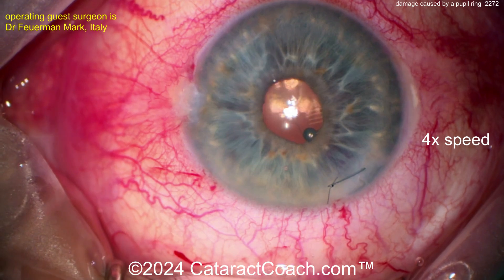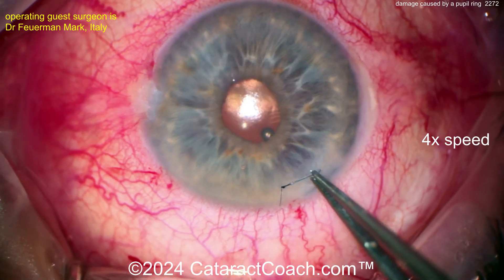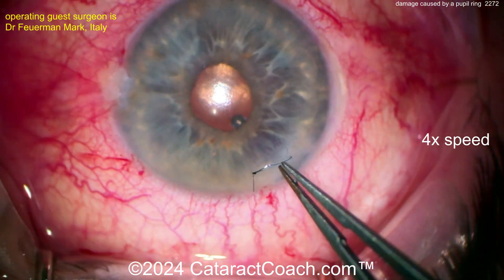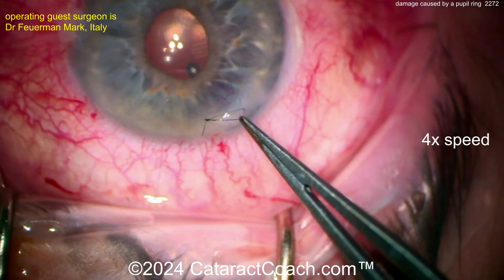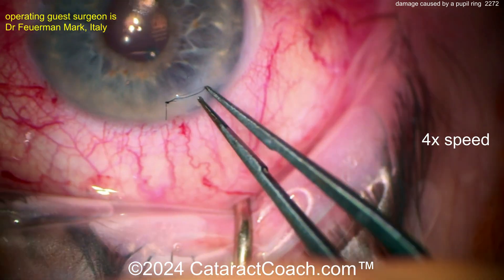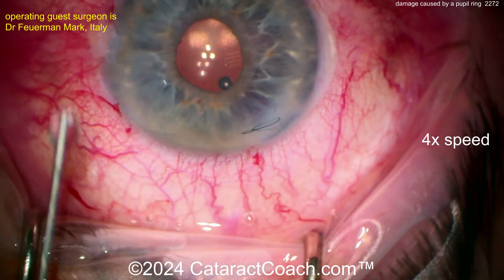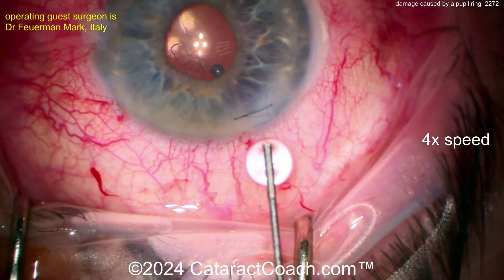This patient's going to have a beautiful outcome. I really admire the surgeon here — he did a beautiful job with a pretty tough case. Remember, anytime you put an extra device in the eye, like a pupil ring of any design or brand, there are more potential issues and complications. Let's get this suture rotated. There we go — now it looks good. Check the incision, make sure it's totally watertight. Leave that suture in for at least a couple of months. Do not take the suture out after a week — it needs more time to heal up.